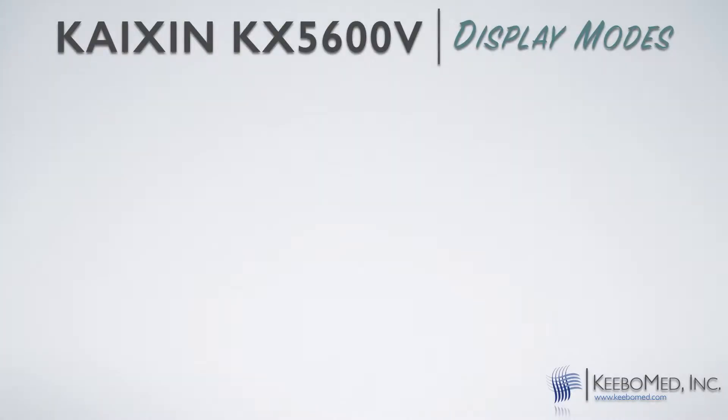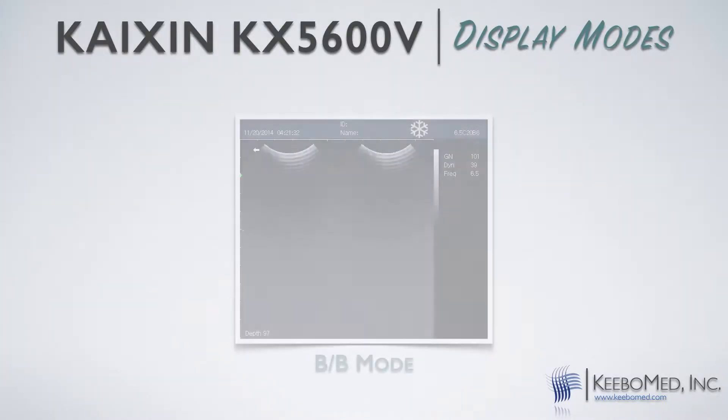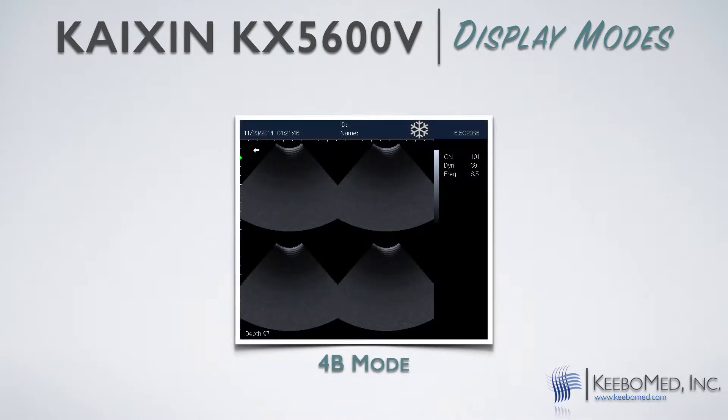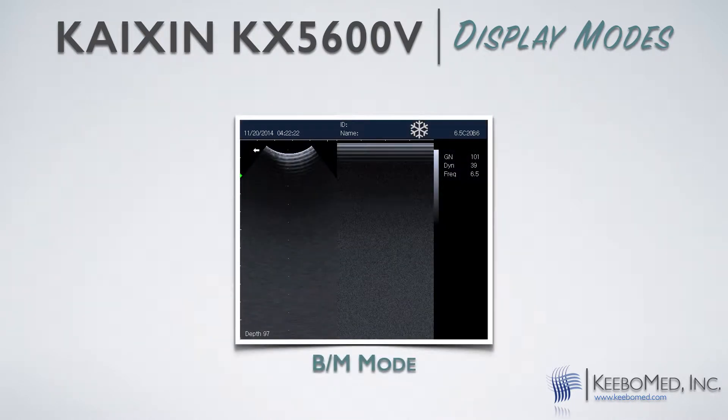The KX5600 is very versatile because it can be used for both large animal and small animal examinations, and even includes a needle puncture guide function. It has five total display modes: B, BB, 4B, M, and BM.